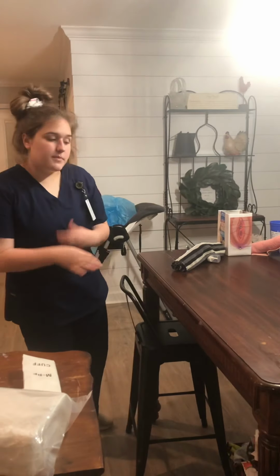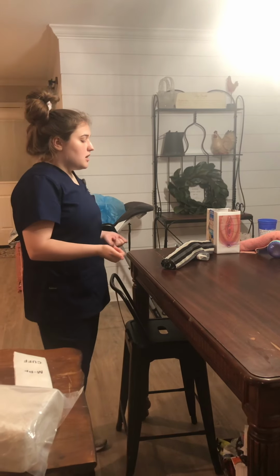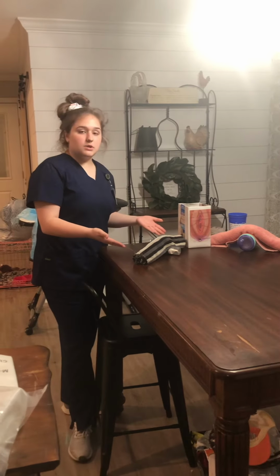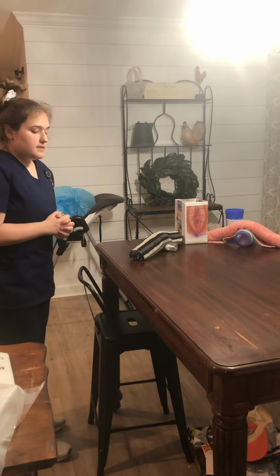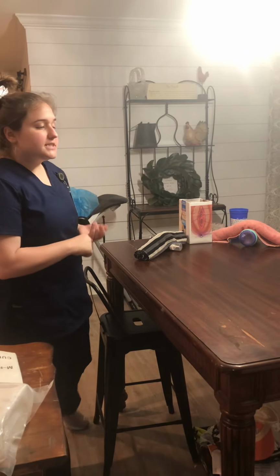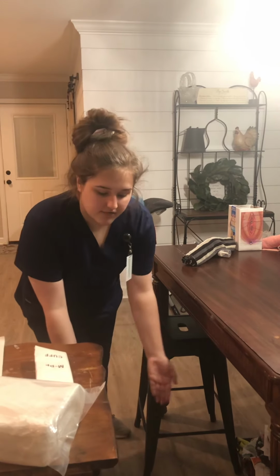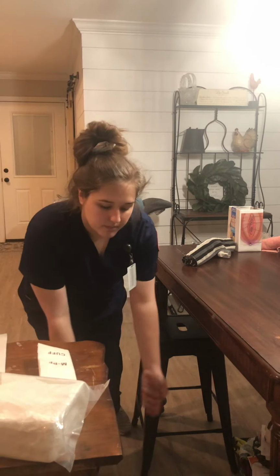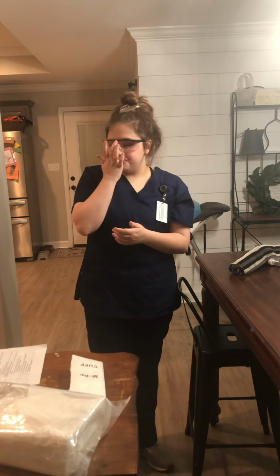Then I'll perform hand hygiene, raise my bed up to working height, and lower my side rails. I would help position my patient in a dorsal recumbent position, which is what I have simulated right here, with their legs apart and knees bent. Then I would explain the procedure to my patient and provide privacy. I'm not going to be using a trash can today, but if I were, I would position it, then don my goggles and perform hand hygiene.